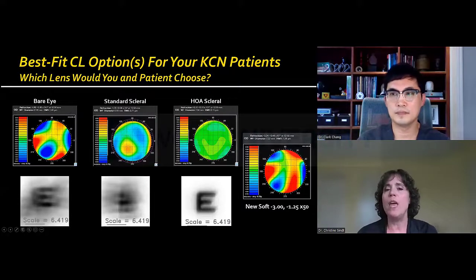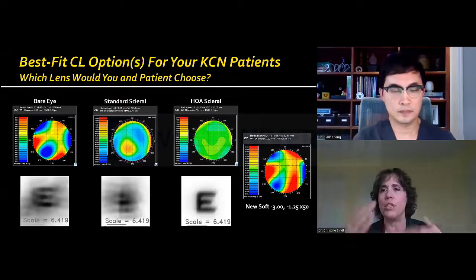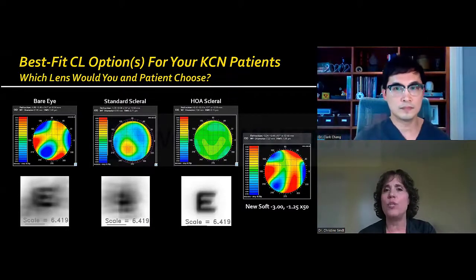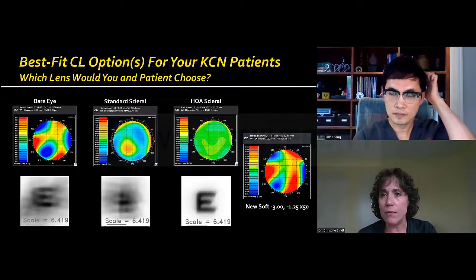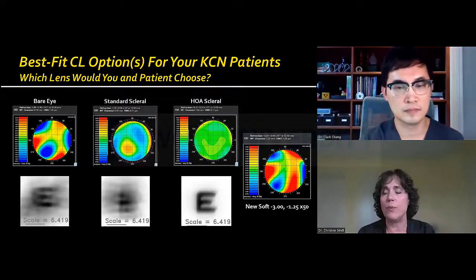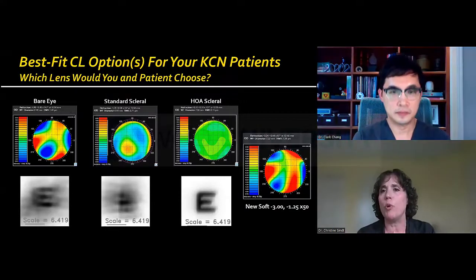So I think it really goes to show a couple of things, Clark, and I know we're ending here, but you can maybe touch on this one last time. When it comes to choosing the patients that you want to correct for higher order aberrations, you have to really make sure that higher order aberrations are their complaint, right? And you may have better options, just controlling their pupil size, than putting them into an HOA lens, so that you can use your time appropriately.